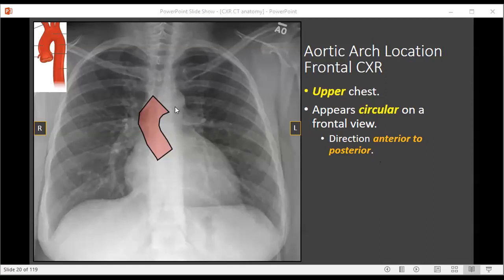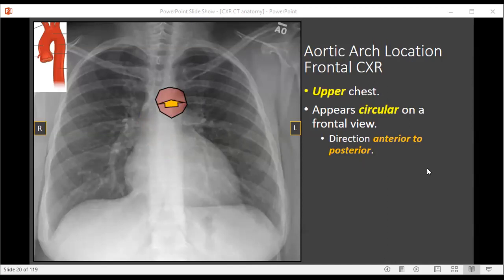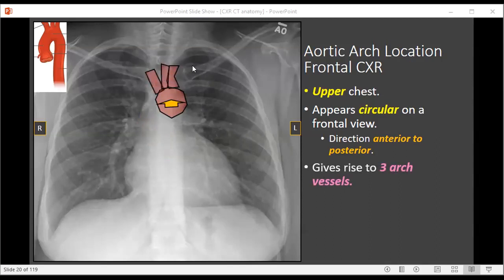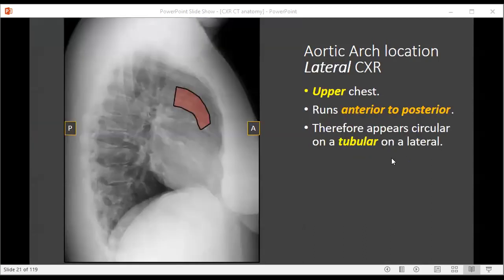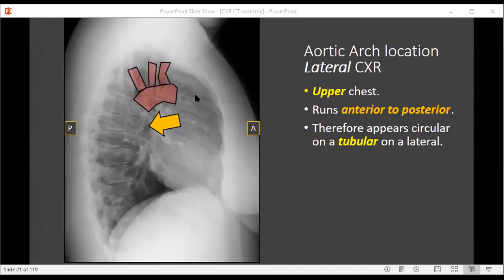After the ascending aorta, the next portion is the aortic arch. Remember the aortic arch runs anterior to posterior, and since we're looking at it anterior to posterior, it's going to appear circular — as if you're looking down a tube. This gives rise to the three arch vessels, which are located in the upper chest around the level of the clavicles. On the lateral view, the aortic arch runs from anterior to posterior. Here's the ascending aorta, and coming off it, running anterior to posterior horizontally, is the aortic arch, with the three aortic arch vessels coming off the top of it.